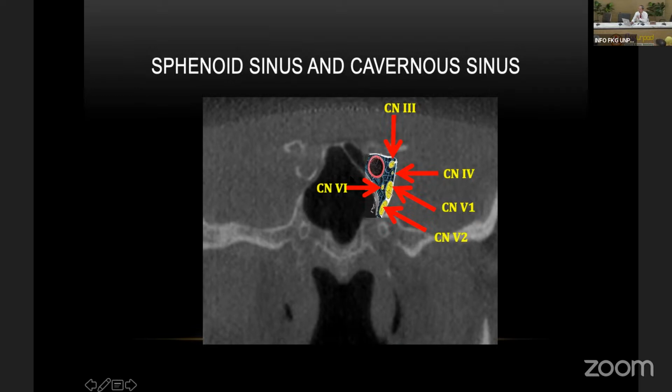Now, one thing in the cavernous sinus we need to recognize on the cone beam is the carotid artery. The carotid artery also goes through that cavernous sinus, and normally it's fine, but sometimes the artery can be calcified, like this one. This is a carotid calcification in the skull base.